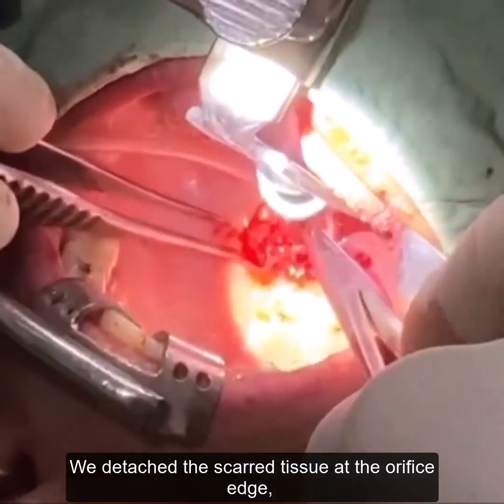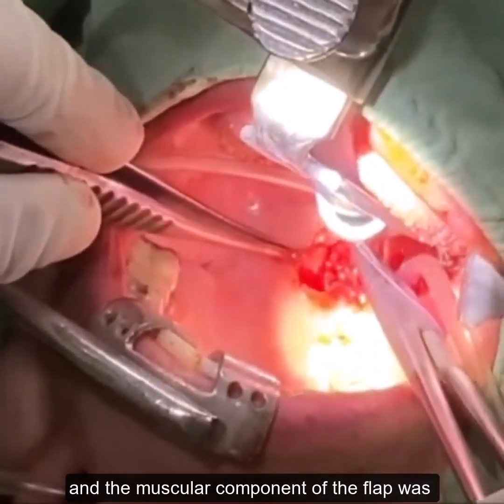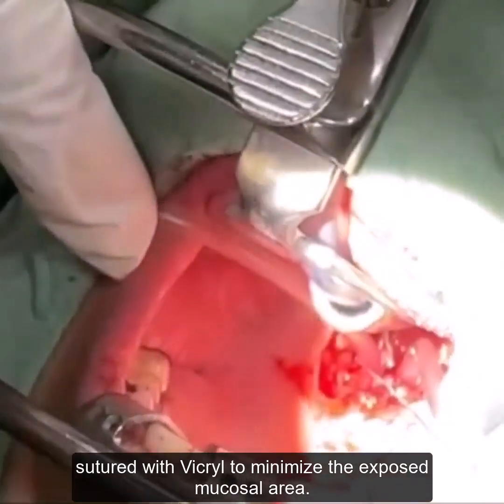We detached the scarred tissue at the orifice edge, and the muscular component of the flap was sutured with Vicryl to minimize the exposed mucosal area.